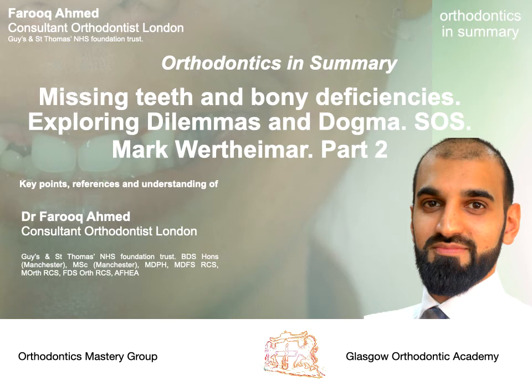So how does this work? Well, the miniscrew is placed laterally, not in a vertical position, which sounds a bit counterintuitive. The rationale behind this is that vertical insertion has shown infraocclusion taking place of the prosthesis and of the bone in that site. How is the prosthesis maintained? Well, there's a spring attached from the miniscrew to a prosthetic tooth.